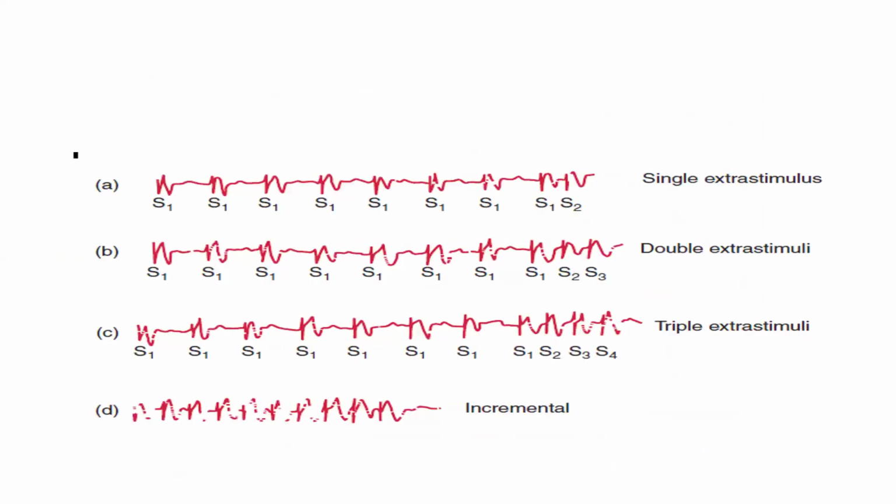Okay, so I want to introduce some terminologies when we are doing EP. Anytime you see the words S1, S2, so that you do not get confused, they mean pacing. S1 means that you're adding a stimulus. That means you're already pacing.